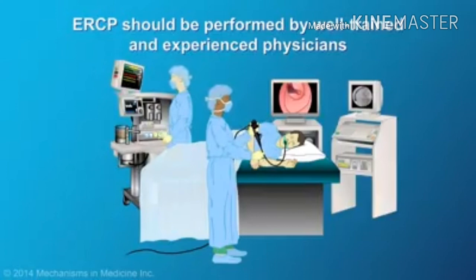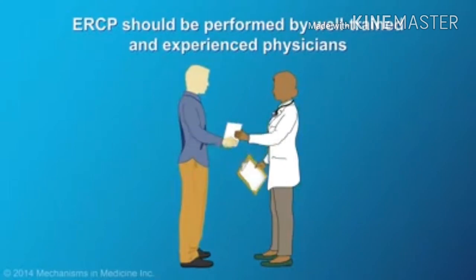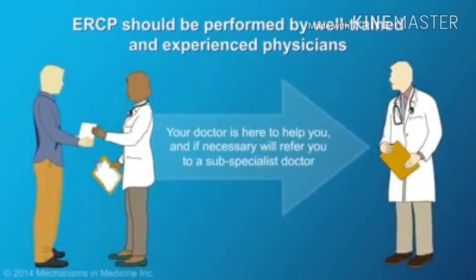ERCP is an advanced endoscopic procedure that should be performed by well-trained and experienced physicians. You should not hesitate to ask your doctor about how much experience they have performing ERCP. Your doctor is here to help you, and if necessary, will refer you to a subspecialist.